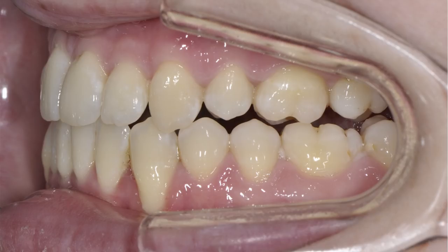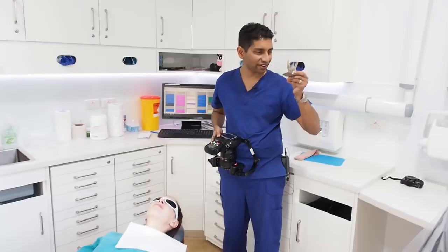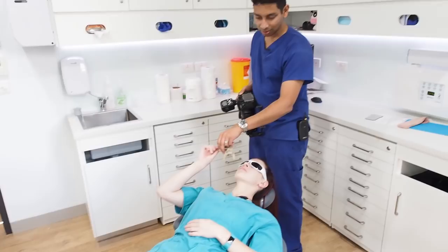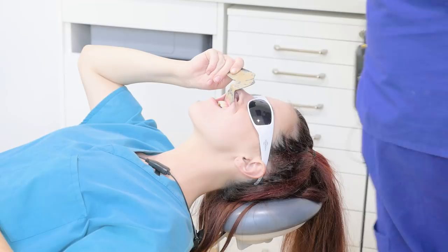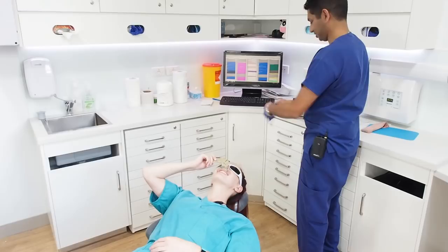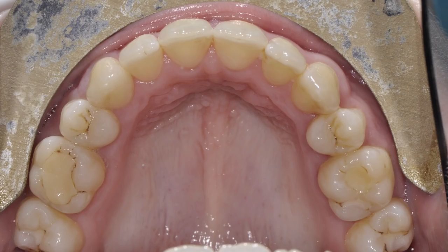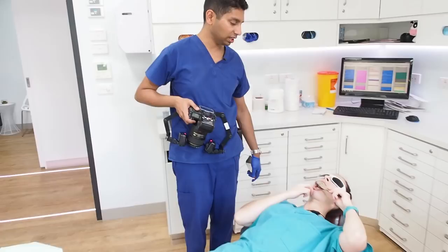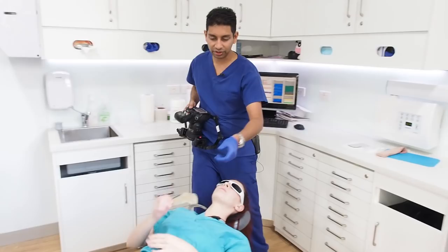I've also got this little horseshoe retractor. Ours has been autoclaved hundreds of times so it's quite grey now, but you can tell the patient: 'This is going to go between your lips and your teeth and hold your lips back.' Pop it in — or help them pop it in — and just hold it up. Then with the mirror, just open if you can.